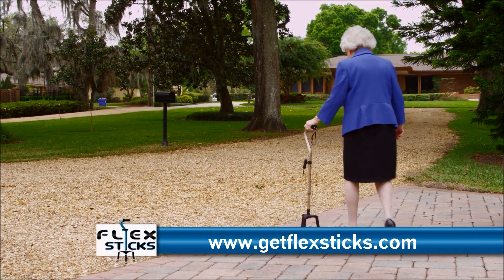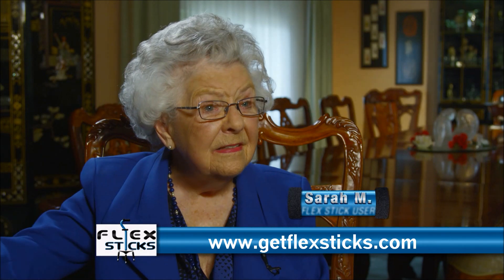If you want to move fast and be secure in your walking, the FlexStick is for you.